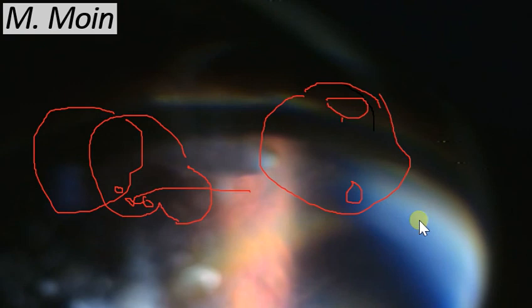And the main procedure you would go in with is a pars plana vitrectomy, clear that vitreous out, and then go in and remove that with the vitreous cutter and clear the vitreous so all the debris is removed, and just close the vitrectomy on fluid. So that's the basic process through this. Thank you very much for watching.